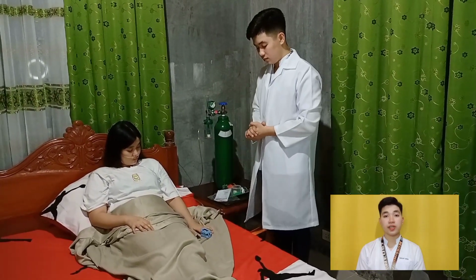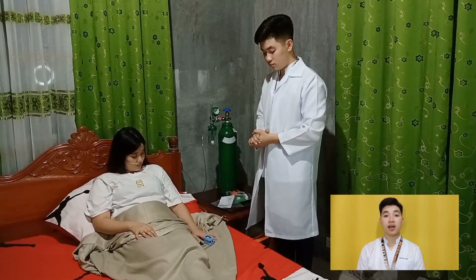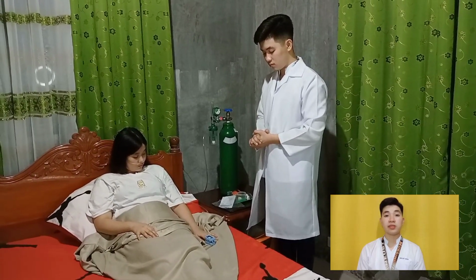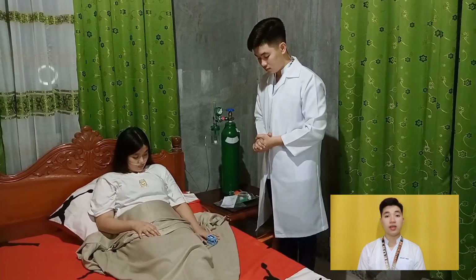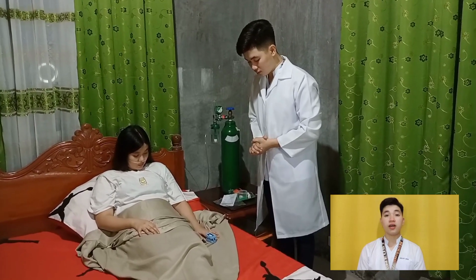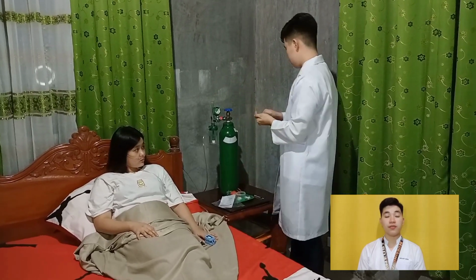Reassess patient's respiratory status, including respiratory rate, effort, and lung sounds. Note any signs of respiratory distress, such as tachypnea, nasal flaring, use of accessory muscles, or dyspnea. Then remove PPE if used, then perform hand hygiene.